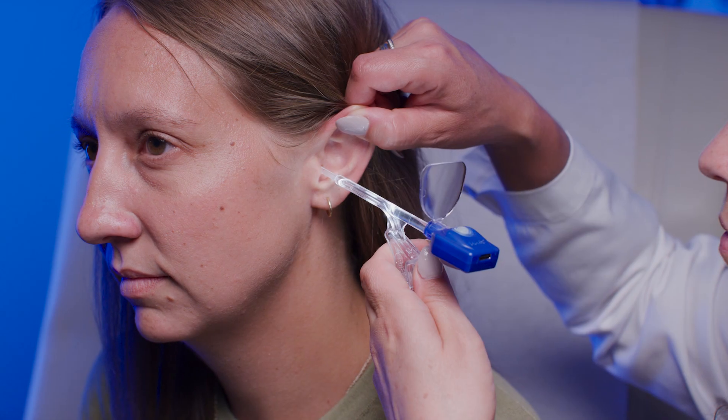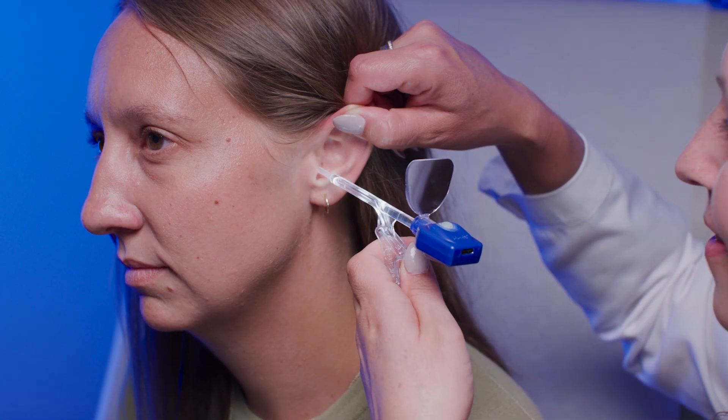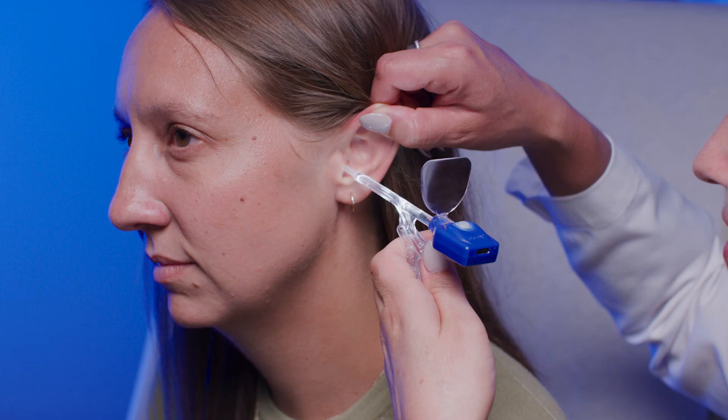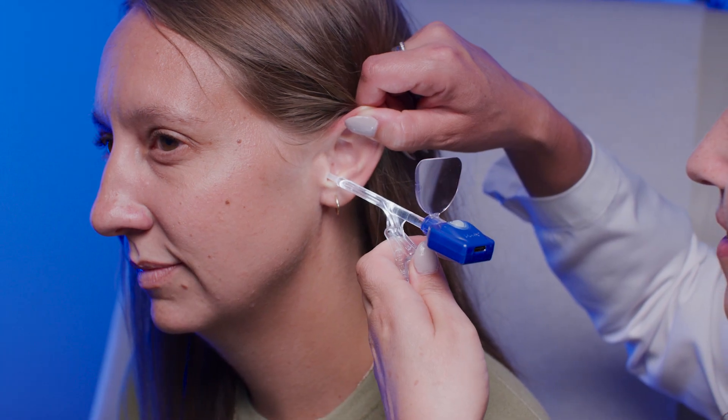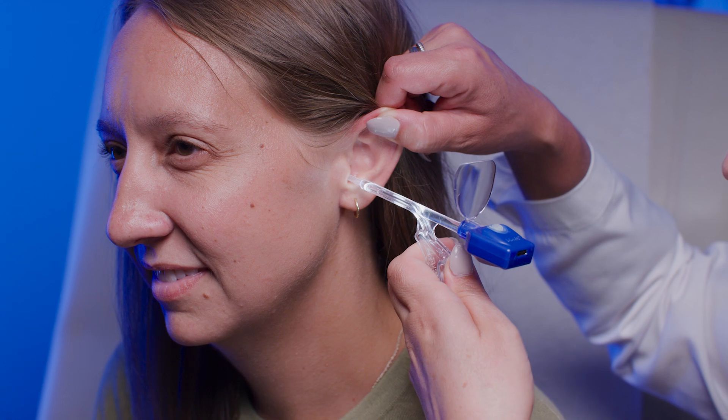Under direct visualization, approach the obstruction. Place your thumb on the suction port on the back of the handle to fine tune the suction. Start with the suction port uncovered, then gradually cover it to adjust suction strength and maintain control as you remove debris.